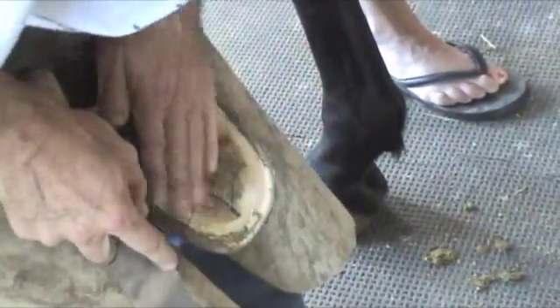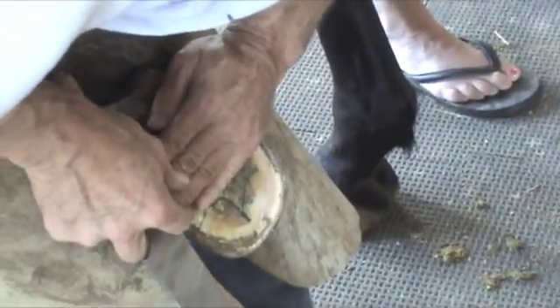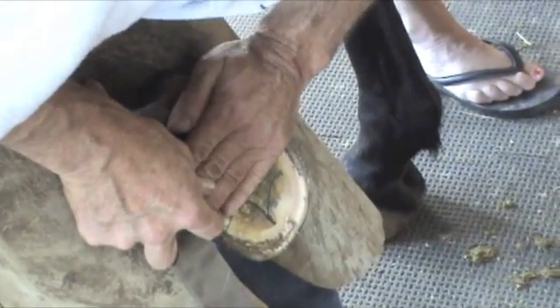So the dental impression material is going to start supporting the whole sole using the other good parts of the foot, so we want to relieve the pressure there.